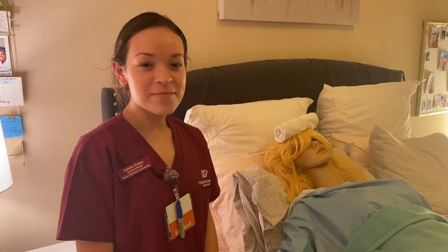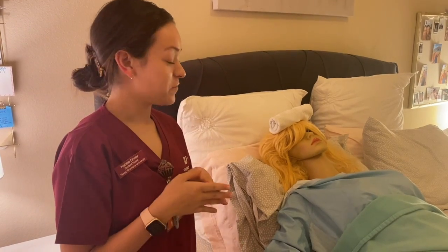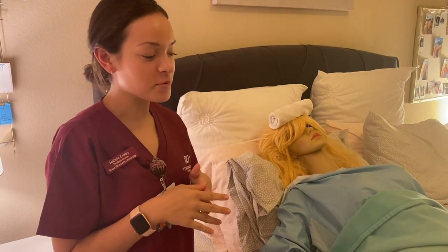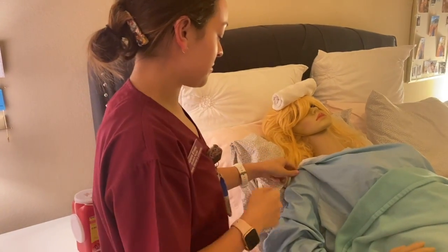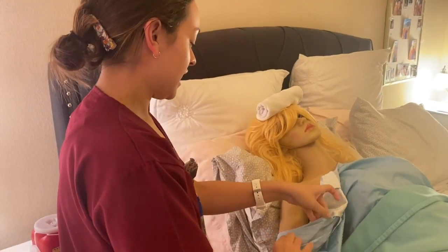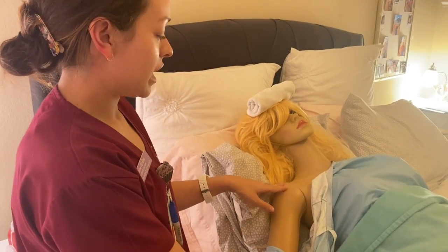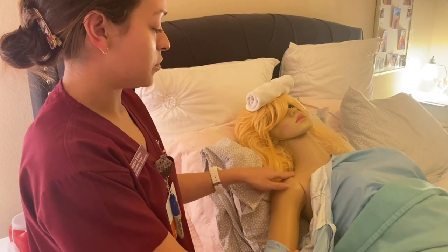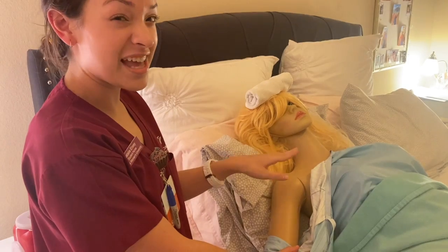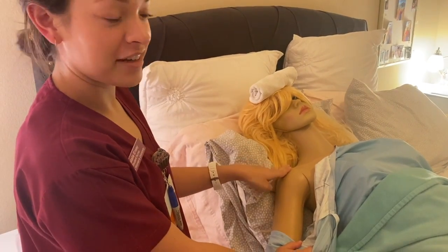Hi, I'm going to be demonstrating the sites for intramuscular injections and the Z-track method. And first I'm going to demonstrate the deltoid site. So I'm just gonna remove her gown. And first I would go to the upper part of the arm and go to the lateral side and try to find the acromion process, which would be around here and on the end part of the acromion process, and it would be somewhere right here.